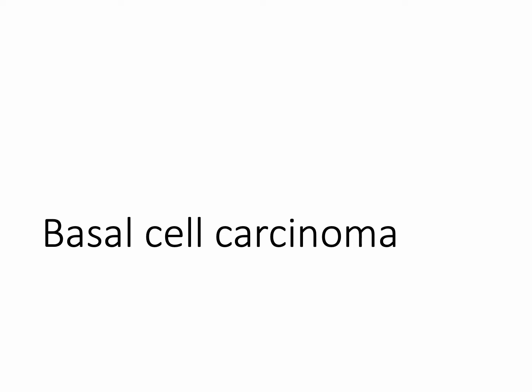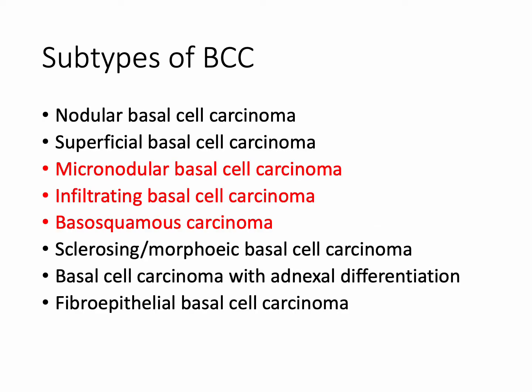Hello, today I'm going to talk about basal cell carcinoma, one of the most commonly encountered entities in dermpath. There are different subtypes or variants of BCC, with the most common being nodular BCC and superficial BCC.